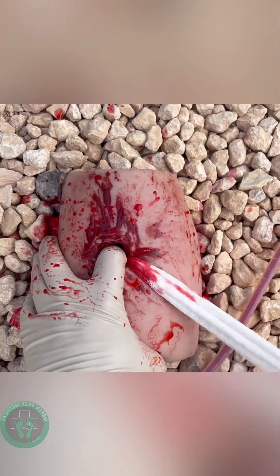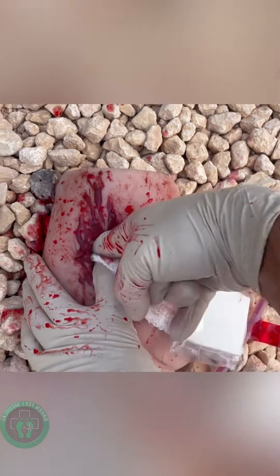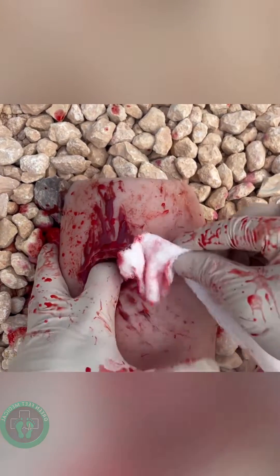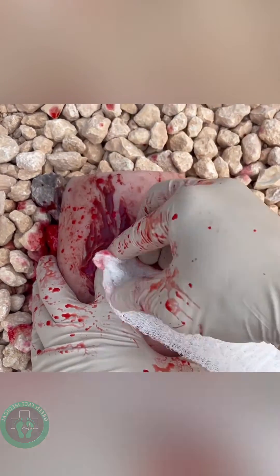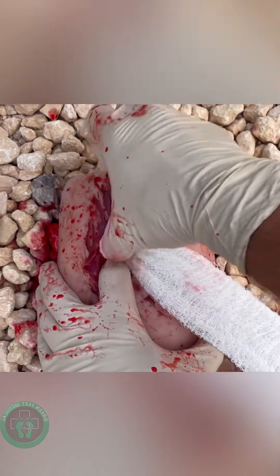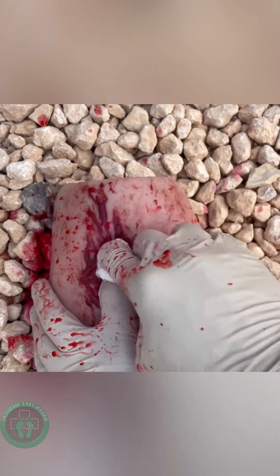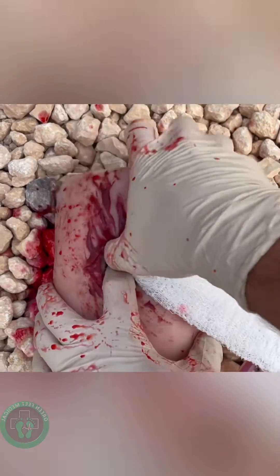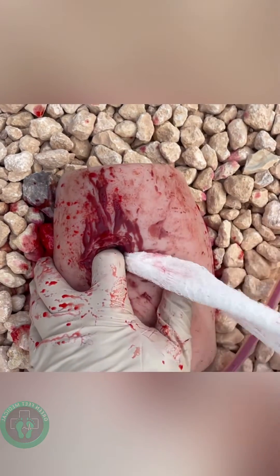So I'm pushing and replacing, holding constant pressure against that artery, and now I'm going to work around my finger here. As you fill in this void space, avoid the temptation to push against where the void space is — keep that pressure towards the artery. Remember: directional pressure, constant. Because if you let up pressure for even just a little bit, the blood is going to find the path of least resistance and it's going to continue to bleed. You'll lose your cork.